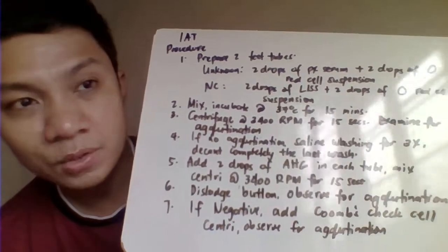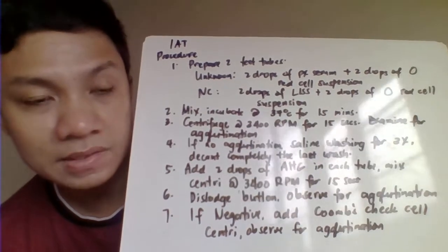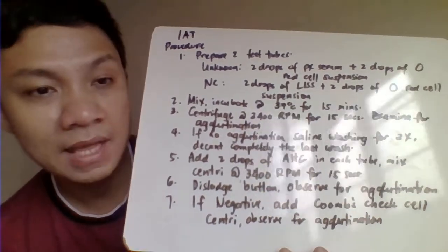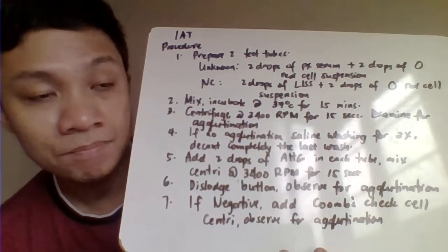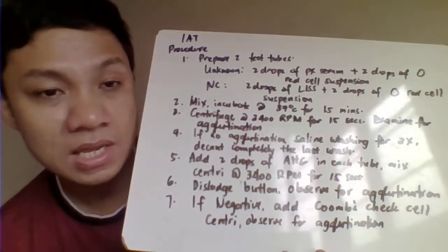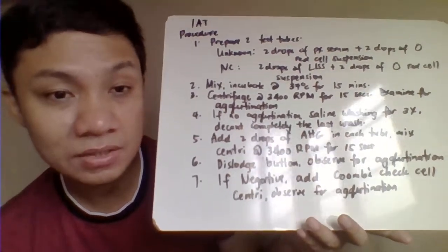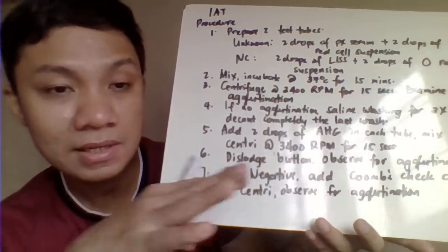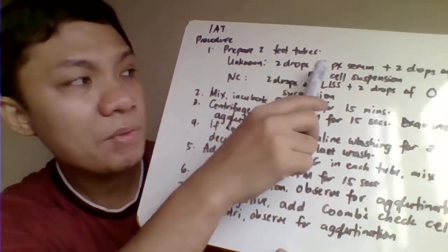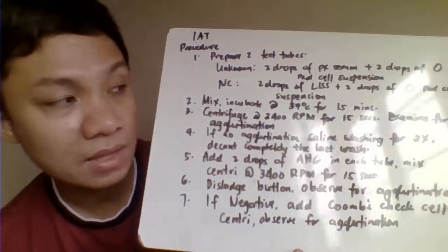So we are doing this anti-human globulin because the anti-human globulin reagent tries to cross-link ang mga RBC natin na may nakasensitize na IgG antibody. Because remember that your immunoglobulin IgG, very small siya, so hindi niya kaya magkaroon ng agglutination reaction agad. So kailangan mo muna ng dalawa na RBC. So para makonekta sa dalawa, that's why we are adding yung anti-globulin. That's the principle of your anti-globulin test.